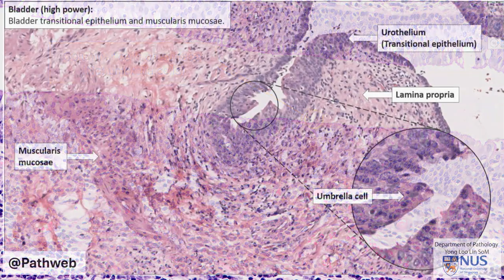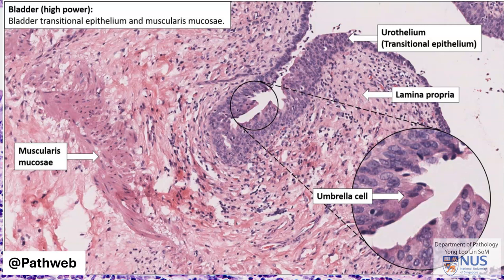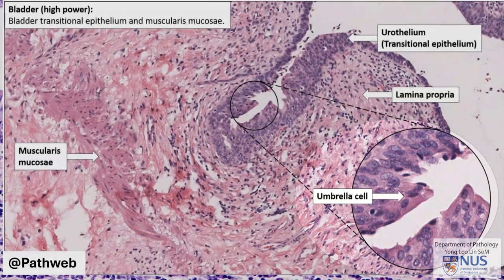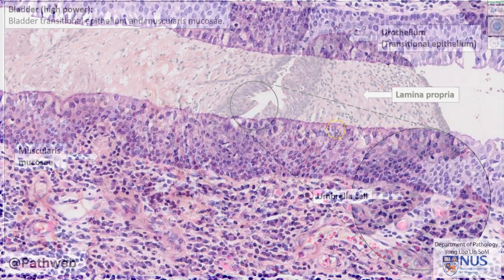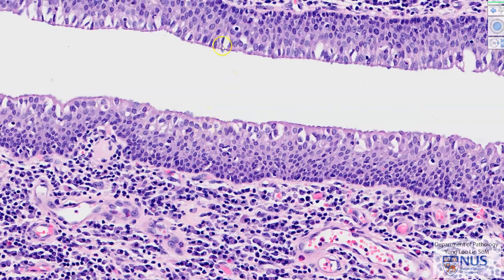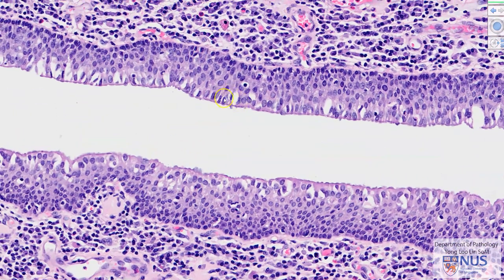Umbrella cells are usually polygonal, very large, with abundant cytoplasm and one to several nuclei. Here we can see that the surface epithelial cells are columnar in shape, and this can also be seen very nicely here.